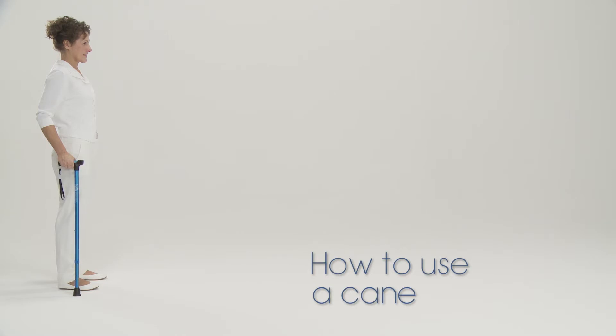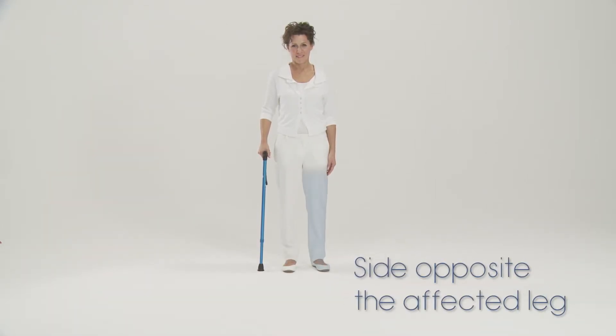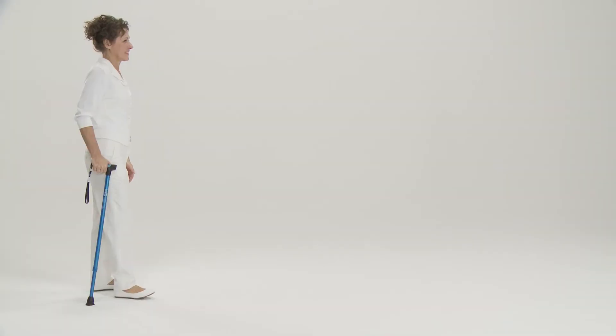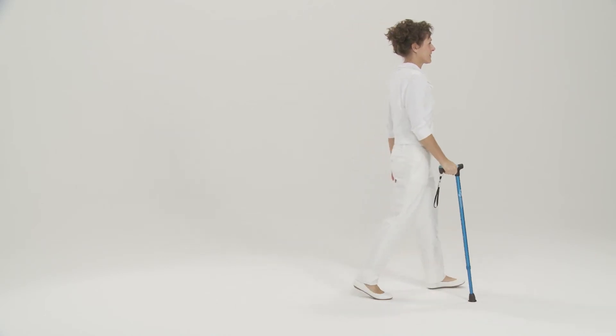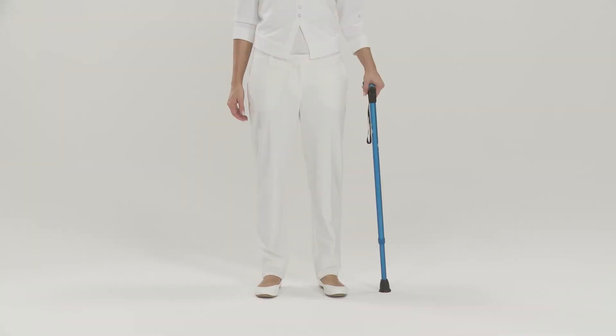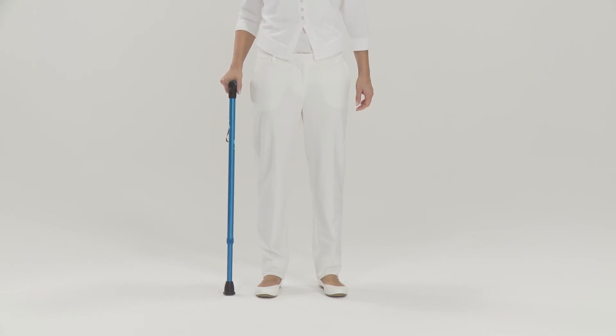Here's how to use a cane. A cane is always used on the side opposite the affected leg. At each step it should move in parallel with the affected leg. If you're using a cane to make walking safer or to help with your balance, you should use it on the dominant side — in other words, on the side of the stronger leg.